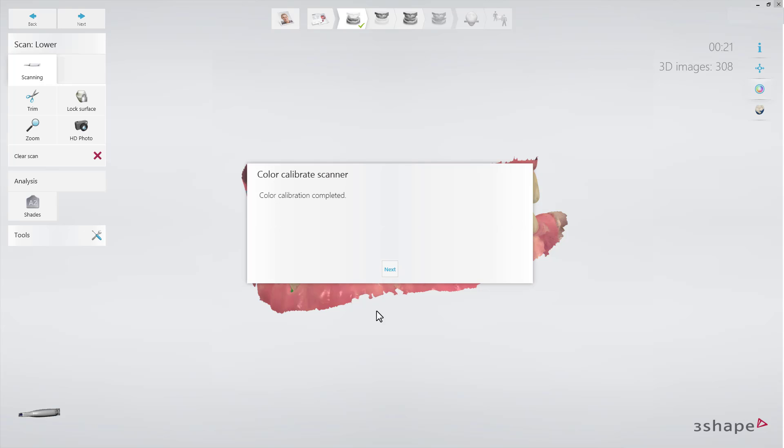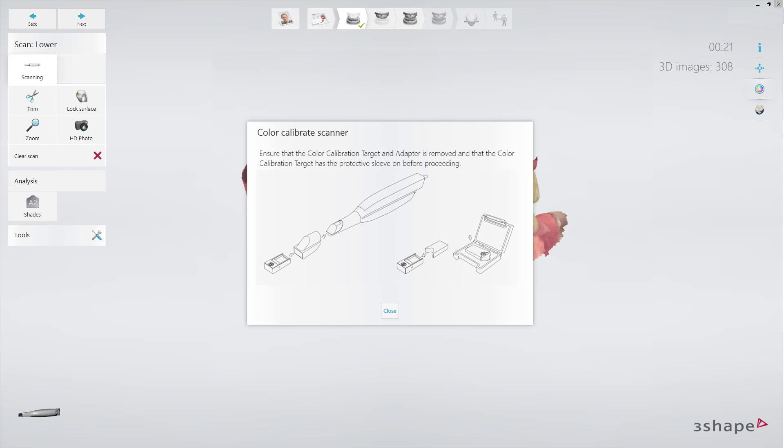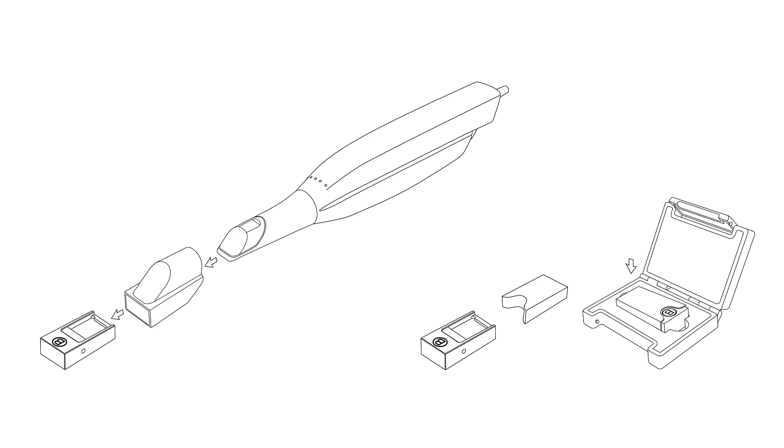Once the calibration process is completed, remove the calibration target and adapter from the scanner tip and put the target into its sleeve.